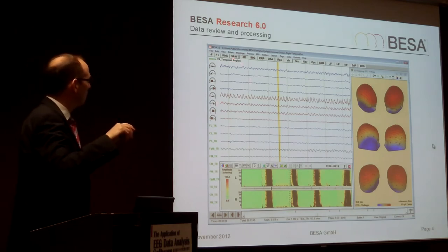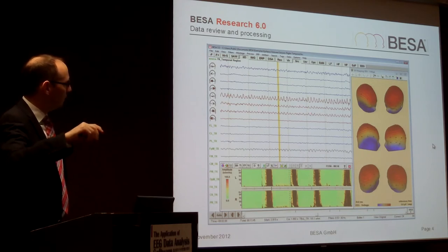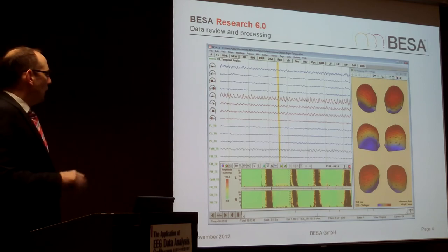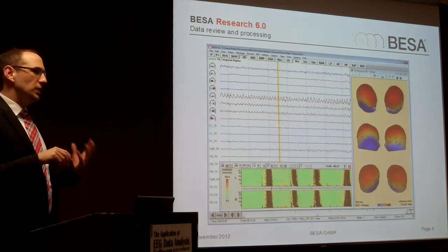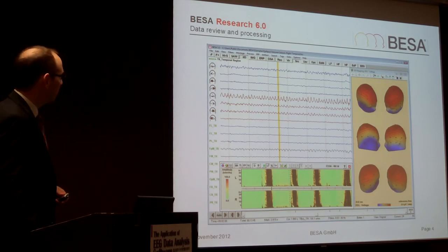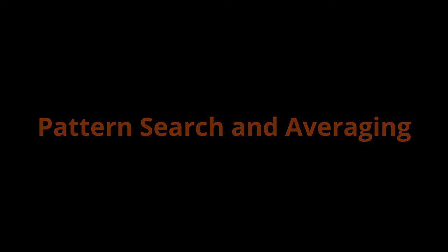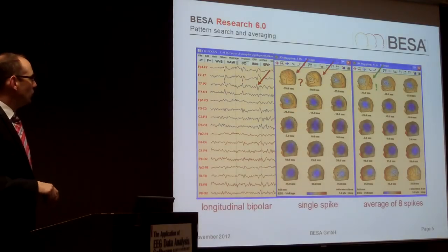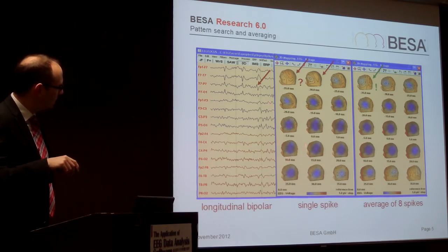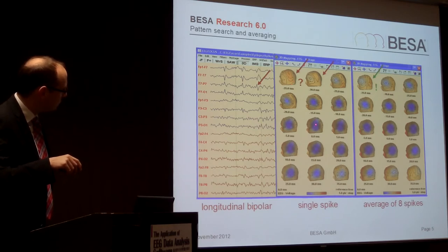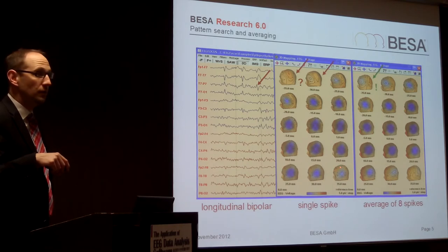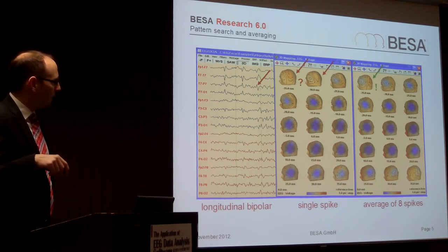So that's basically one of the windows we have. You see the EEG waveforms, the 3D maps, and in this case a DSA — a dense spectral array analysis. That's basically what you need for data review. You can also do trigger handling, set markers, set comments, whatever. Then we have pattern search and averaging. You can see a spike here — this is an epileptiform spike. If I map this spike, you can see over time how this epileptiform activity comes in and goes out.